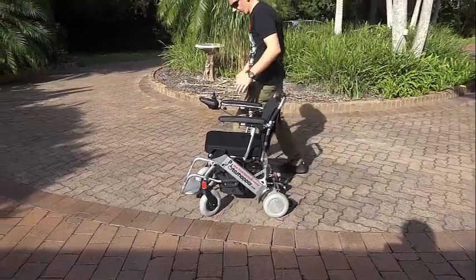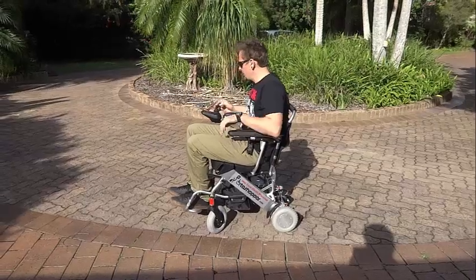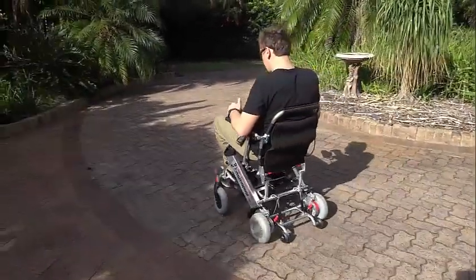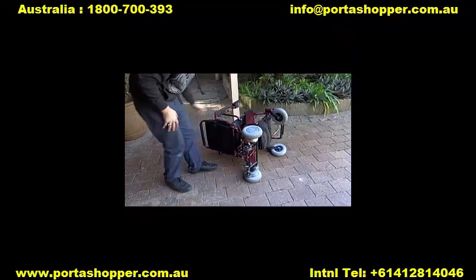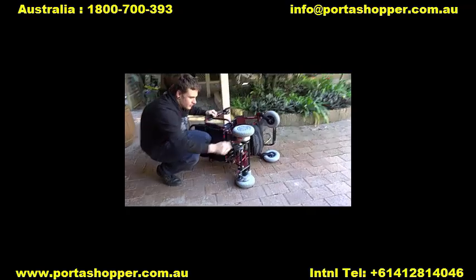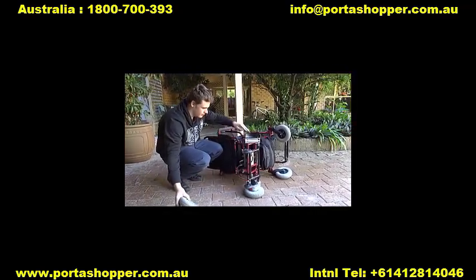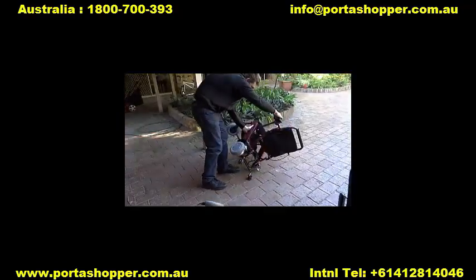Other than that, it's a fantastic unit for children and medium built adults weighing up to 100kg for indoor and outdoor use, and about 110kg for those who want to use it on flat areas only. It has built-in anti-tip wheels and a footrest that rotates inwards and upwards, as well as armrests that flip up completely to make side entry very easy.